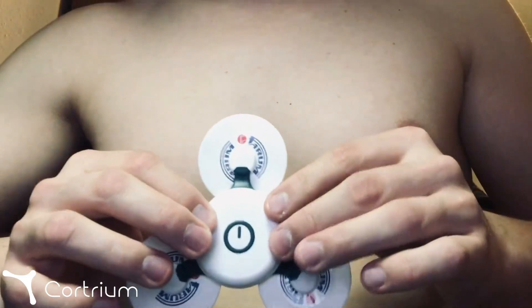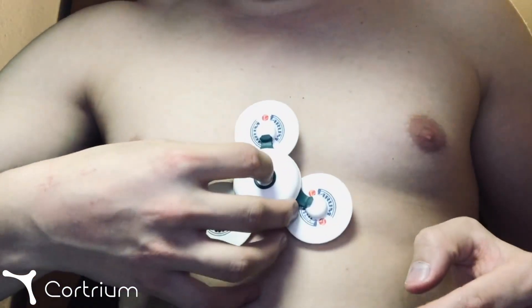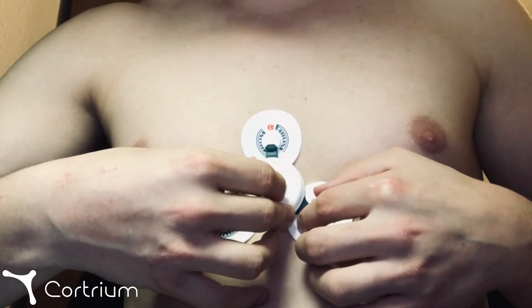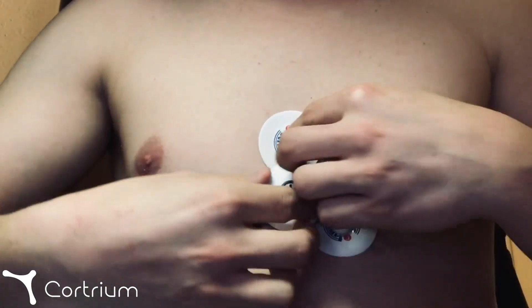Please make sure that the adhesive sticks properly to the skin and that there is no air between the electrodes and the skin. We recommend exercising light pressure on all the electrodes individually to double check that they stick to the skin properly.